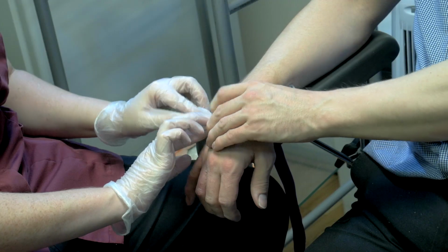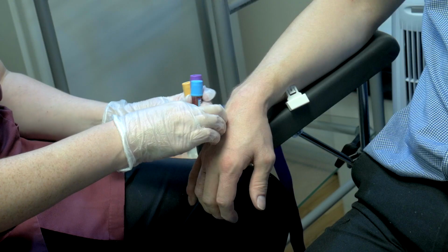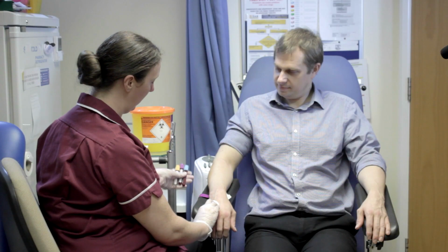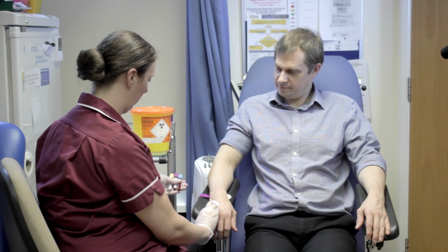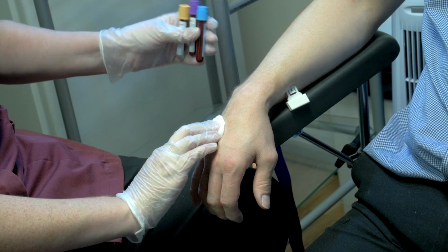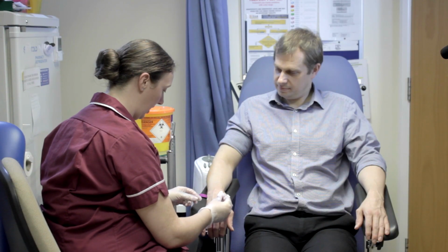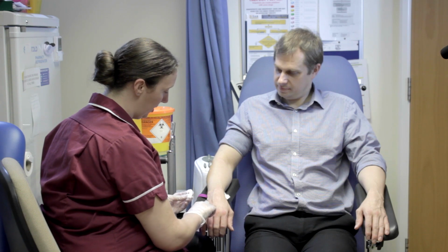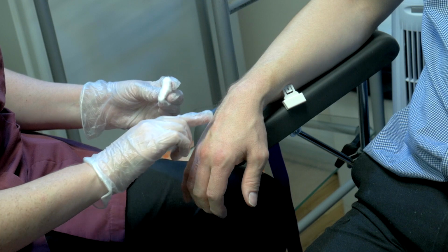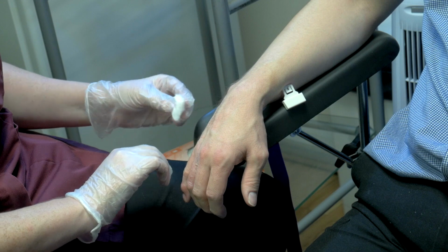At that point, I want to make sure my patient is okay. And I will pick up my tubes. I've already checked they're full, so I'm just going to do my inversions. So that's all done. And much the same, I'm going to apply as much pressure as I can to the site to try and stop any bruising, and we can see that it's nicely stopped bleeding, and also we can see that there's no sign of bruising at this stage.